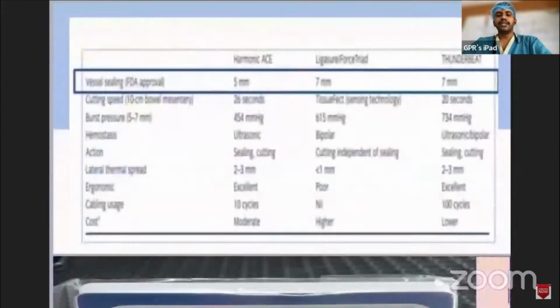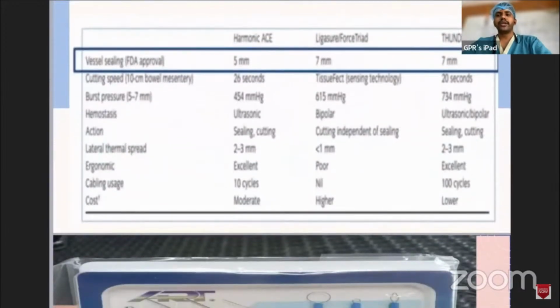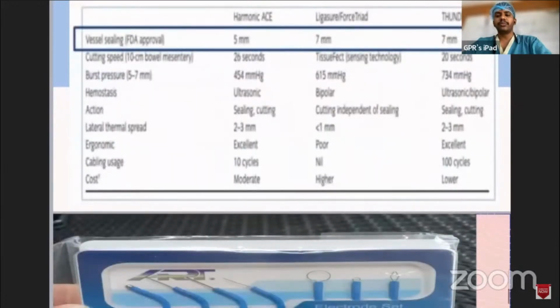Electrocautery burn is a serious criminal negligence as far as Indian legal penalization is concerned. When it comes to the final topic, the choice of device is either Harmonic, LigaSure or Thunderbeat, out of which what is used is FDA approved. I preferably choose LigaSure as more good and best. We have the cutting instrument as well as the coagulation instrument, and the energy dissipation is very low. Even though it is cutting, we should be very careful while it is performed.